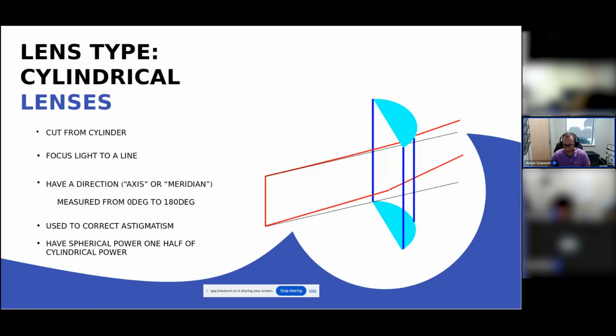It's not that important that you know what that looks like for most of the light path, but at some point, or at some plane, I should say, it becomes focused to a circle, and that is the circle of least confusion, and that is what we're looking for in someone with astigmatism. That's basically the best you can get with just focusing light with a spherical lens in someone with astigmatism. So then once we have that, we'll try to refine the astigmatism, collapse it so that the light comes to a point. But more on that later.